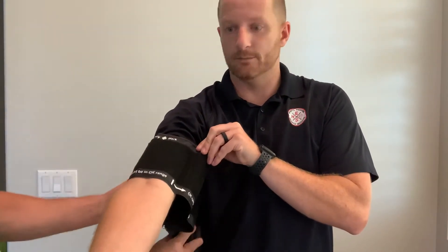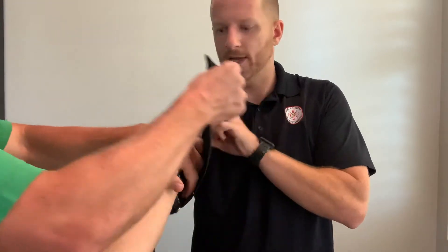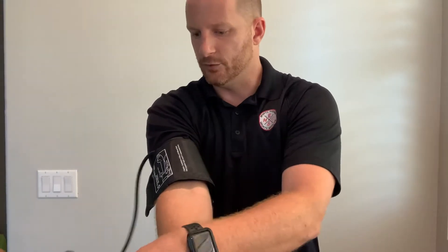I want to make sure that artery picture is in the right spot. We want to tighten up the blood pressure cuff — it's just velcro — tighten it up, put it on, and then plug the wire into the machine.